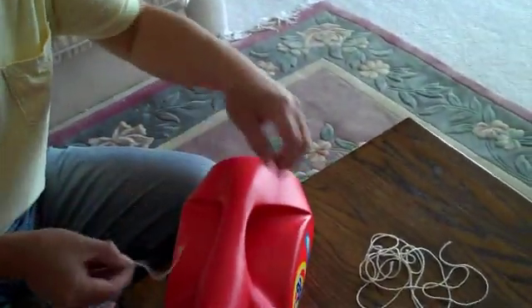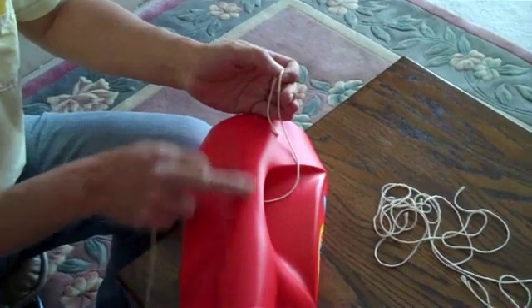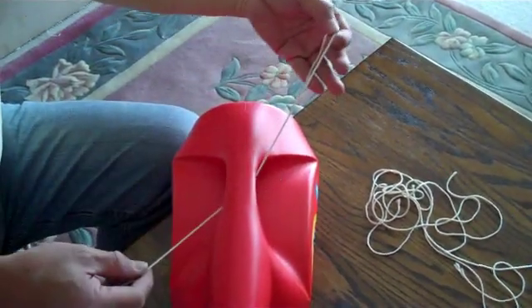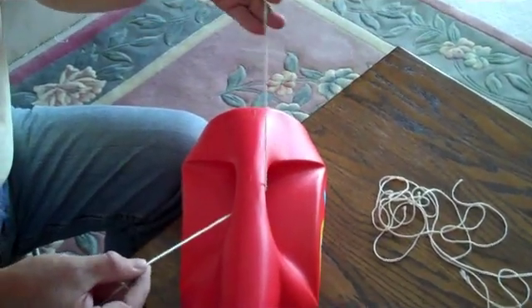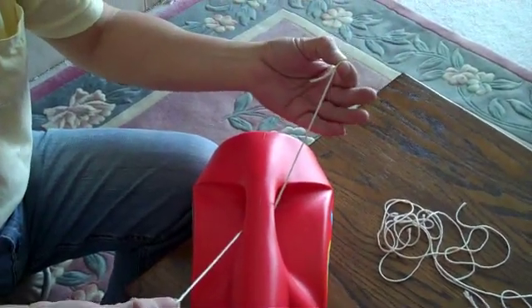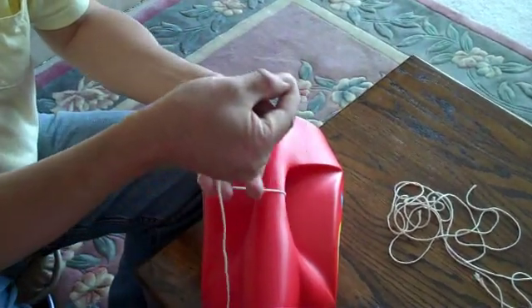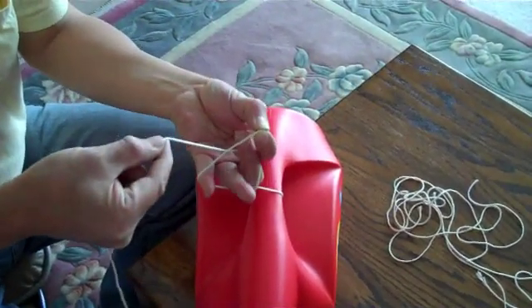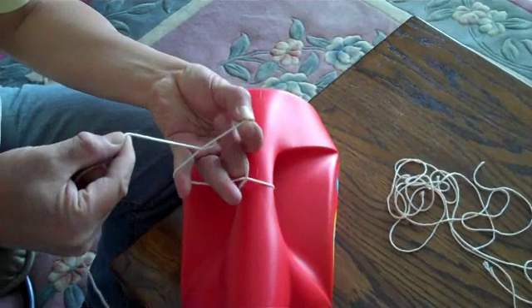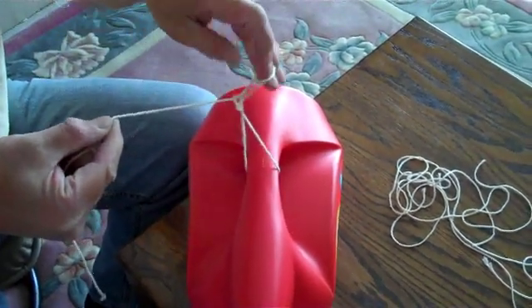First thing you want to do is you want to pass the string under the structure that you'd like. And you pinch the string between your index finger and the thumb on both sides like this. First thing you do is you put it this way and then you use your middle finger to hook the string this way.